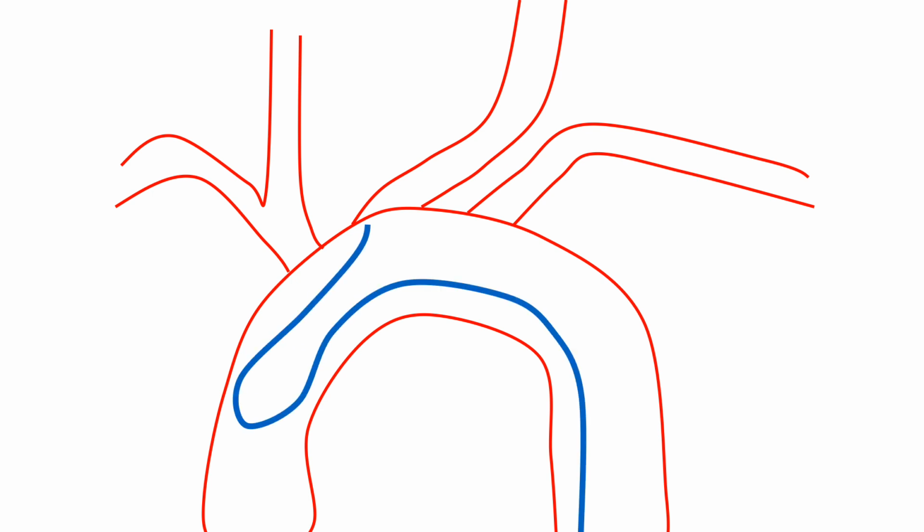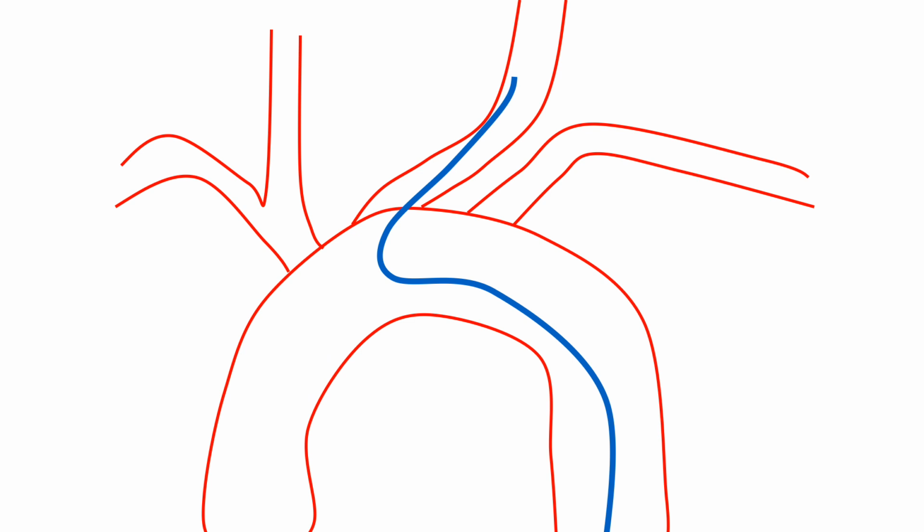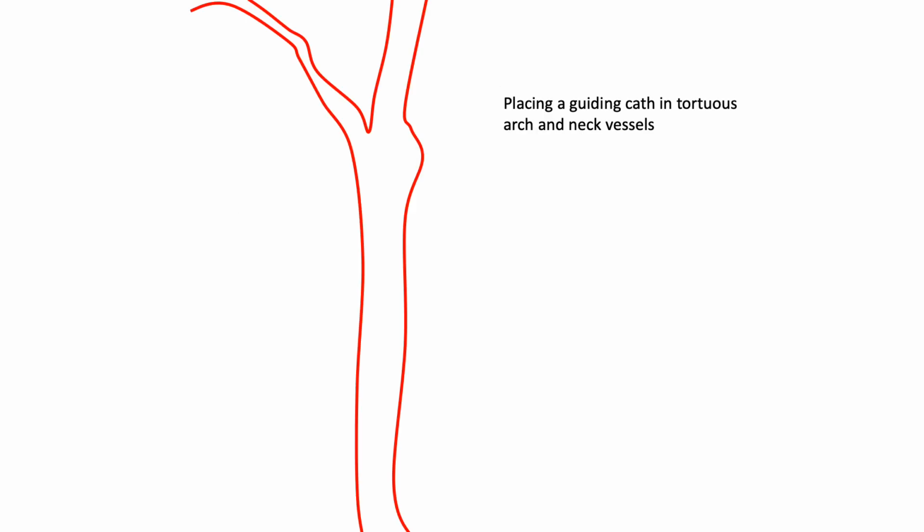But it's very easy. So when you have an arch of this sort, the best catheter to take is the Simmons 1 or the 2. So what you would do is take it into the ascending aorta or at the junction between the arch and the descending aorta, and you'll make the curve. Once you've got the curve, as you inject contrast gently, you will hook the ostium and pull the catheter and you'll enter the vessel. The same is done for the innominate as well as for the subclavian artery, and individually you can hook these vessels.